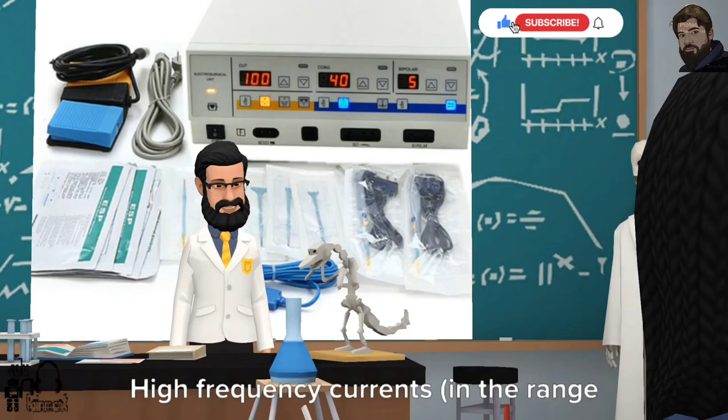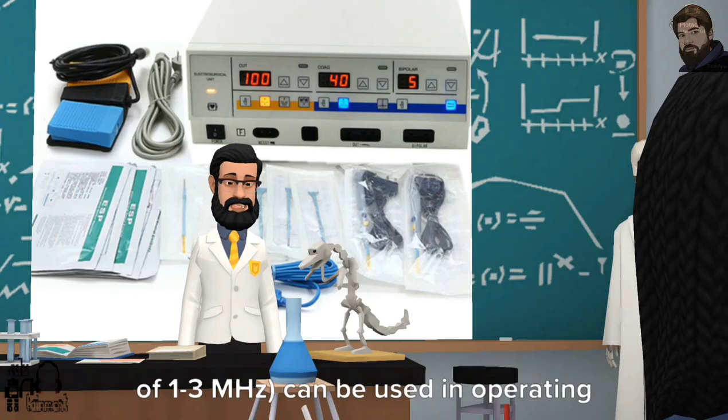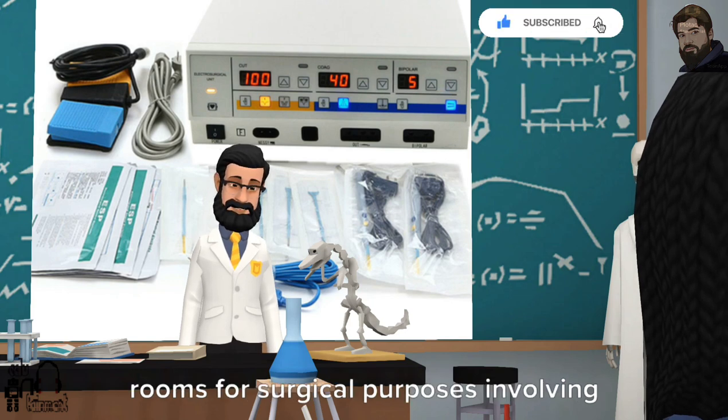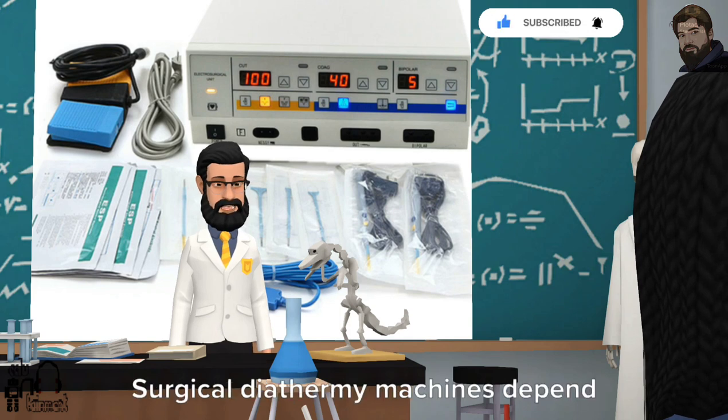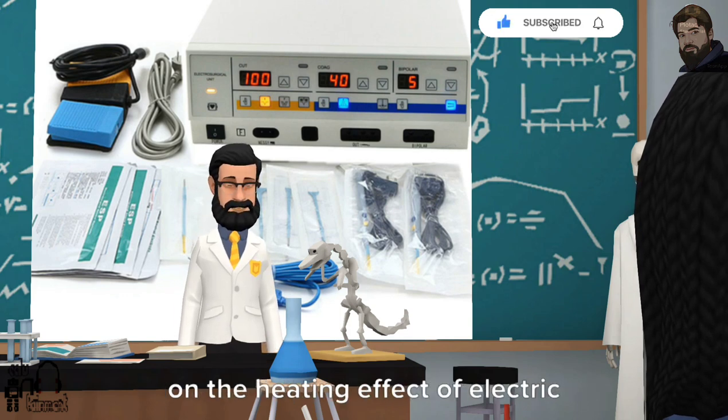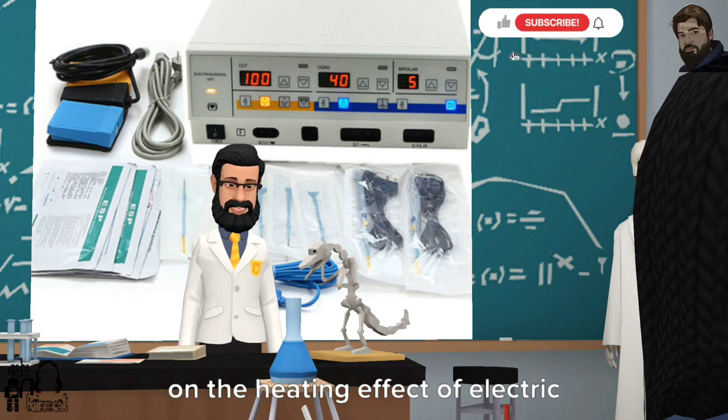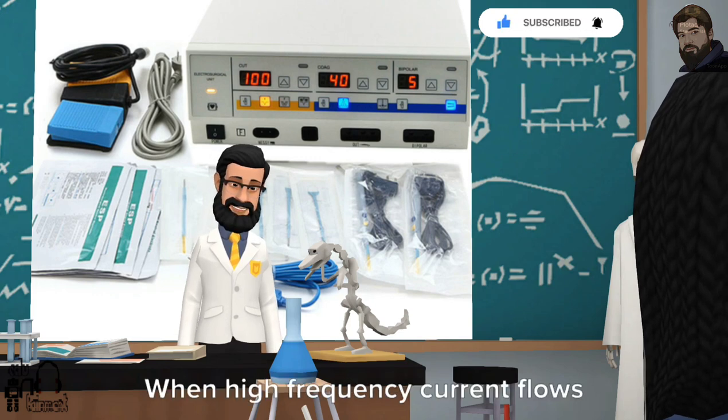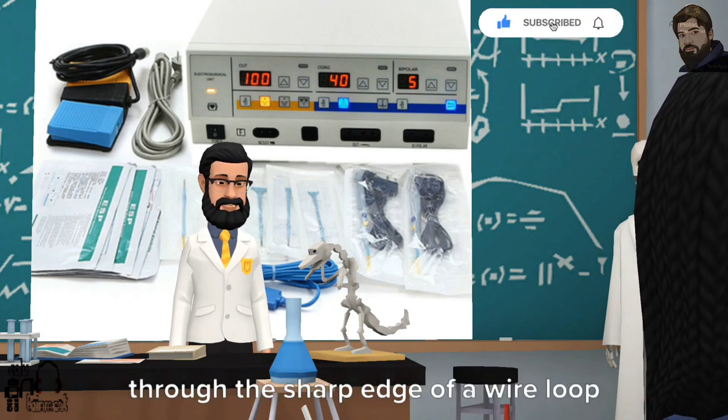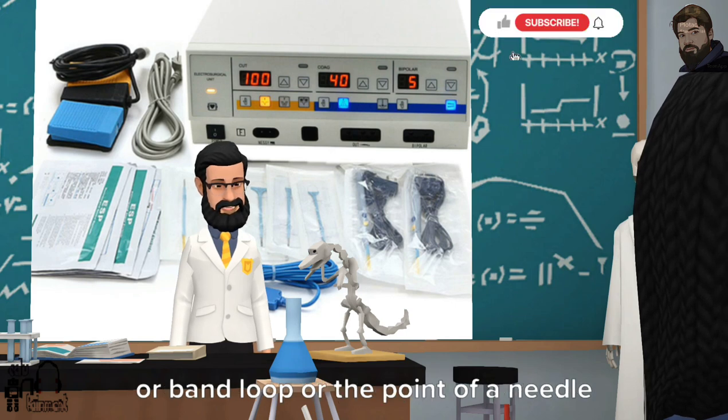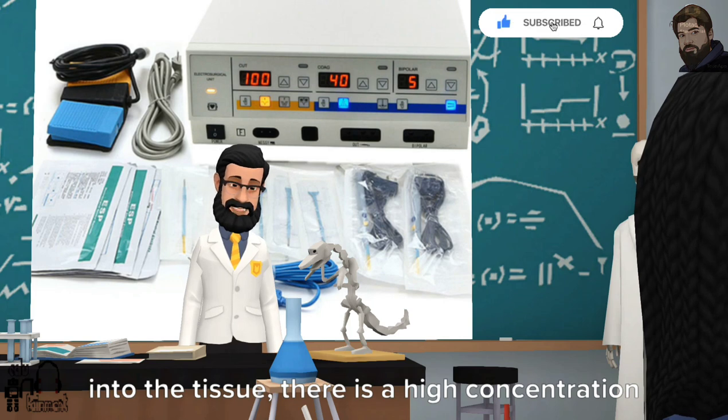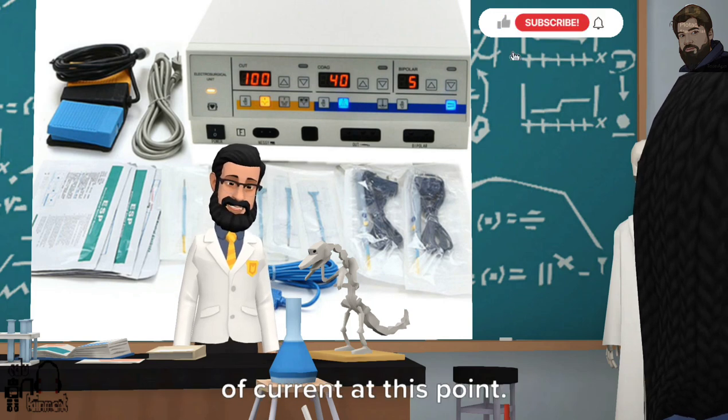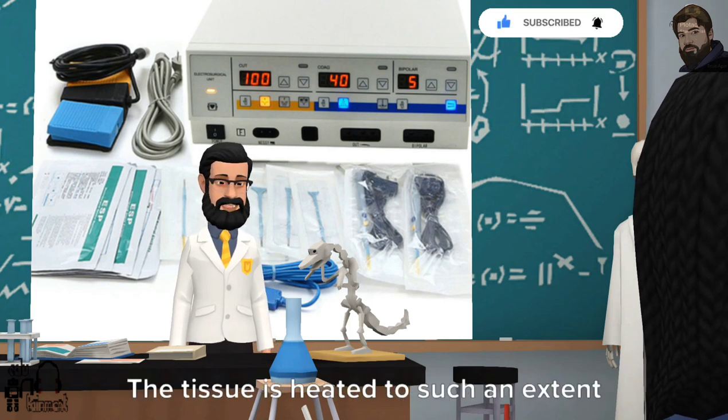What is the principle of surgical diathermy? High frequency currents in the range of 1-3 MHz can be used in operating rooms for surgical purposes involving cutting and coagulation. Surgical diathermy machines depend on the heating effect of electric current. When high frequency current flows through the sharp edge of a wire loop or band loop or the point of a needle into the tissue, there is a high concentration of current at this point.